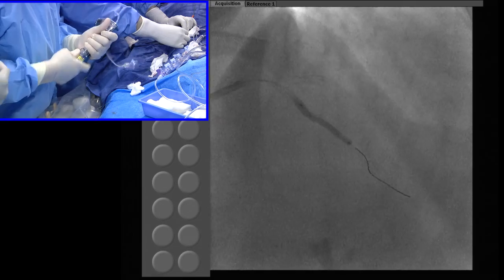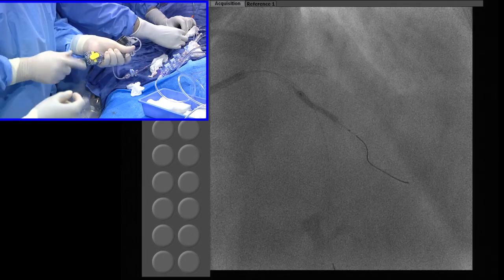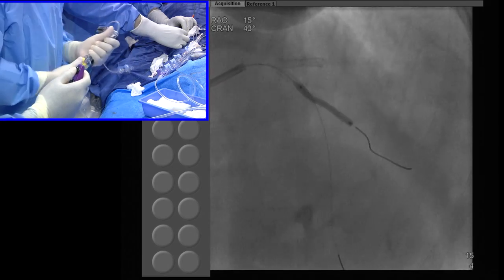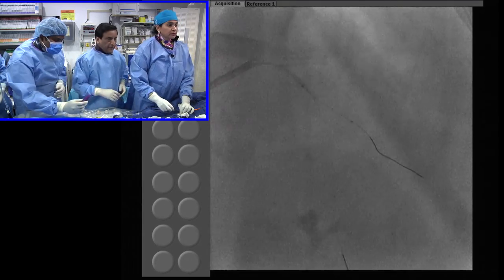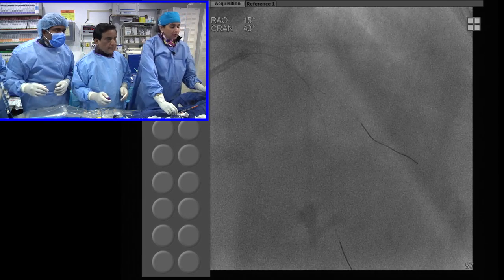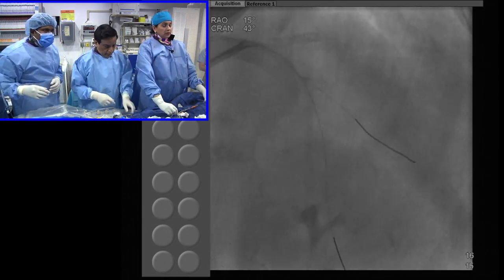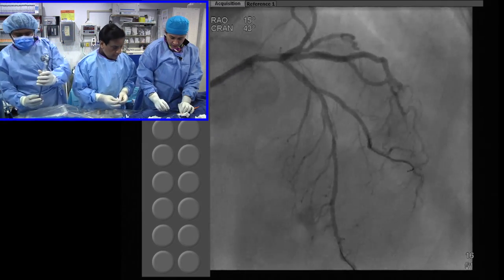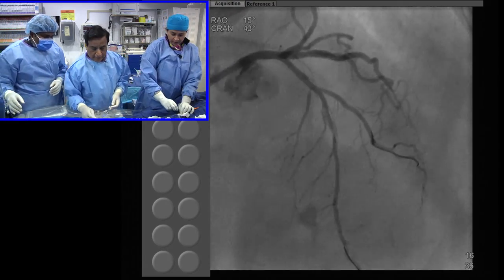Now at the ostium, do you want to do a cutting balloon? Okay, let's see it now. This has opened up nicely. It's a 14 atmosphere, 2.5. Let's take a picture. If need be, we have a low threshold for doing lesion preparation. Okay, ready? Go. If you want, we can use the cutting balloon now. But it looks okay. Probably don't need any cutting balloon. There's just a chunk of calcium at that ostium. Then fine. Then 2.5, let's get the 2.5 Flextome.